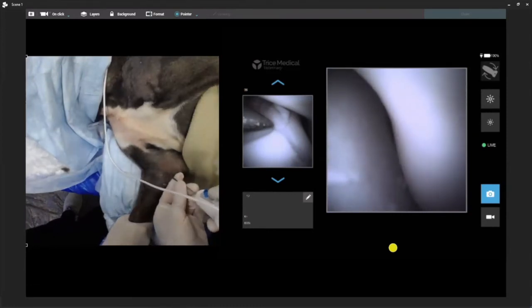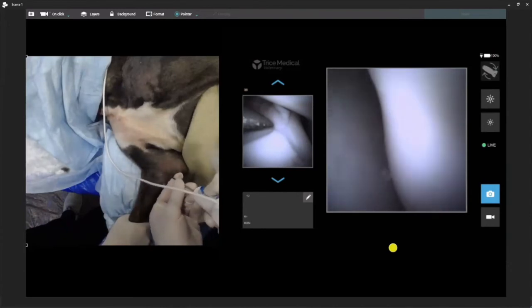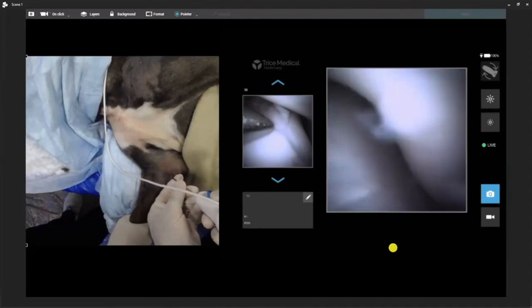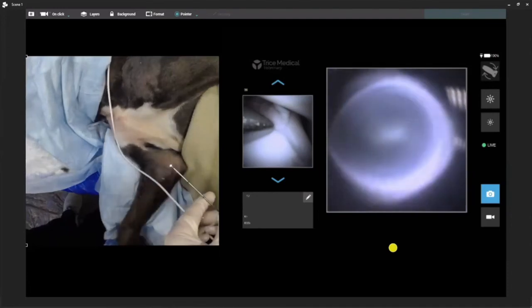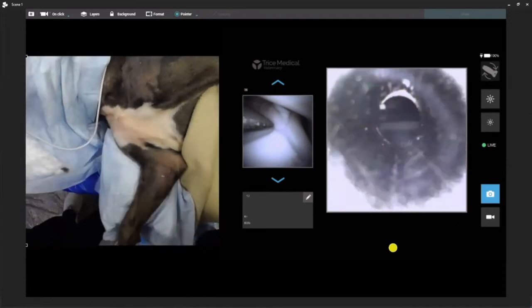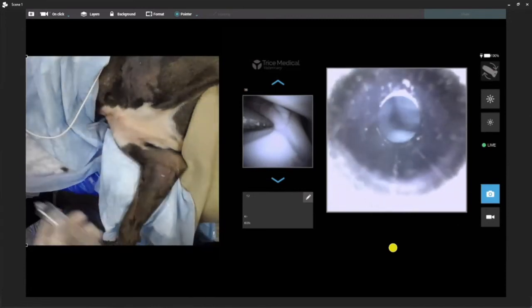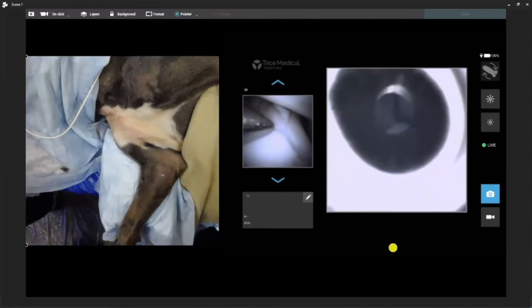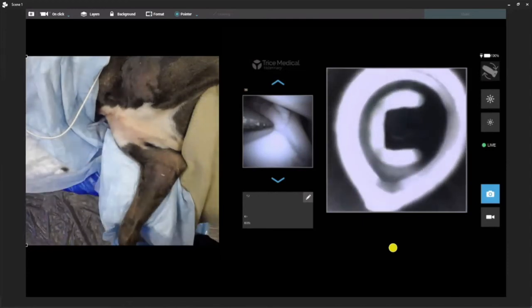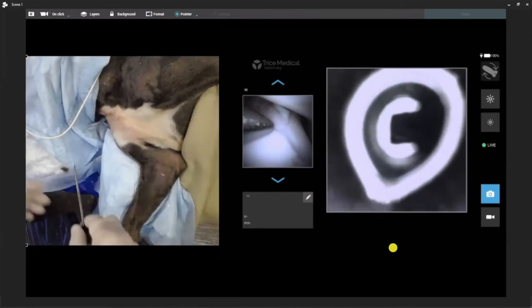So let's go ahead — we're going to slide one more time into the stifle. Any questions coming up? Okay, so far so good. We're going to pull this out, make sure our optics are retracted. Classically for a stifle scope, I have the patient in dorsal recumbency with the limbs hanging off the back of the table. Obviously you can see how we're set up here, so that's not going to be an option.